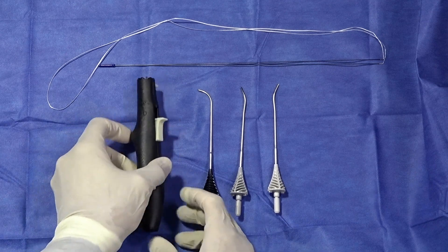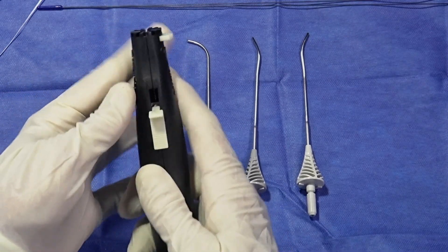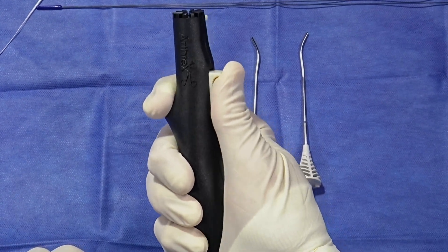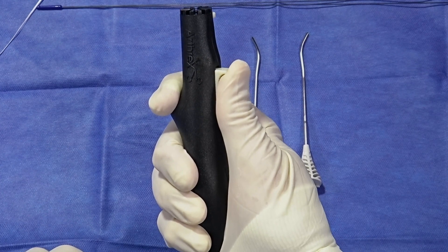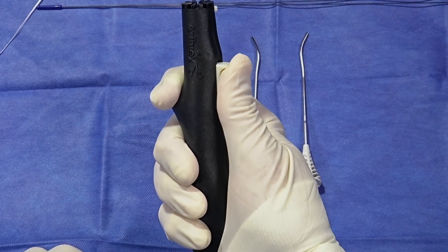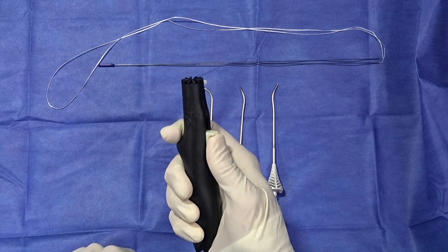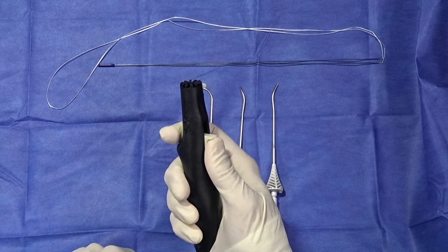I'd like to introduce the Zone Navigator, which is an ergonomically designed device which can be used with one hand to advance a needle inside-out in one centimeter increments. You can also withdraw the needle simply by using your thumb.